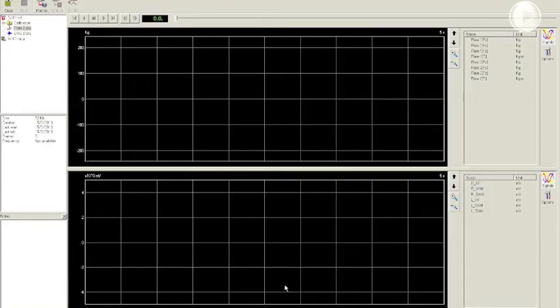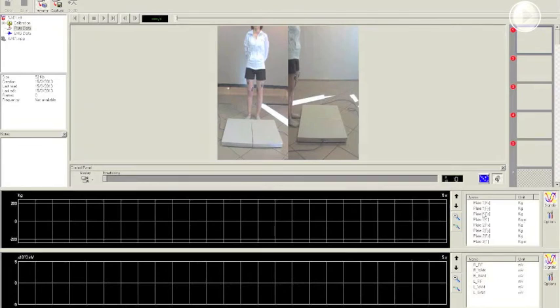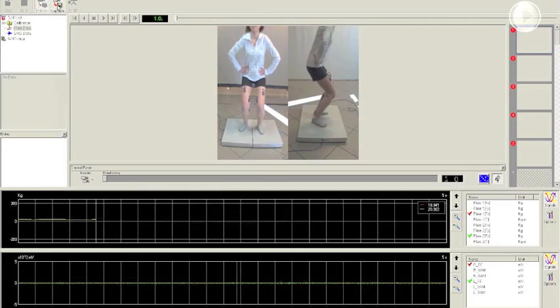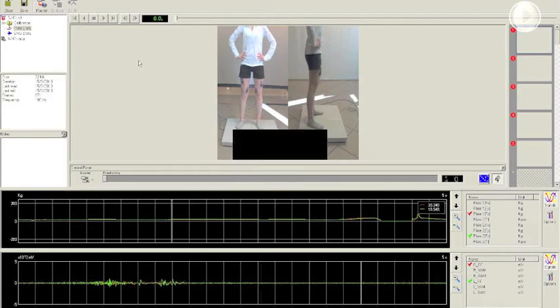Okay, here we have the screen. We can decide to see also the recording. We click on monitor. This time, my subject will have to start with bended knees in order to start from the static squat jump. Okay, so go over the platforms. Okay, this is the static condition. We click on capture. 1, 2, 3, and jump. And we stop the acquisition. We save the data.